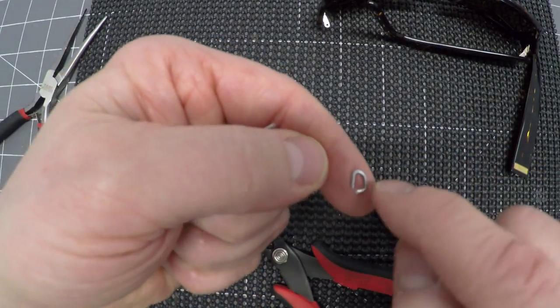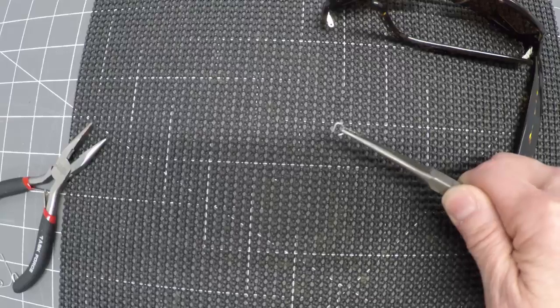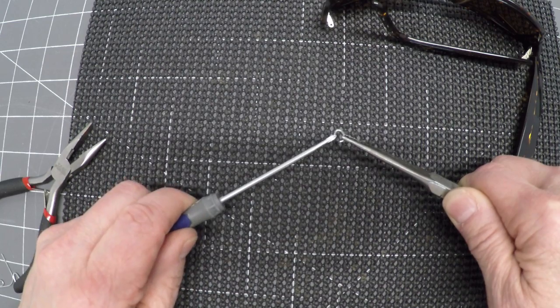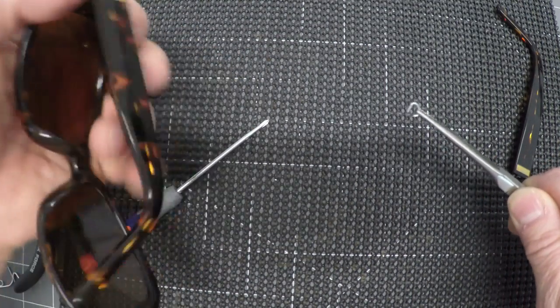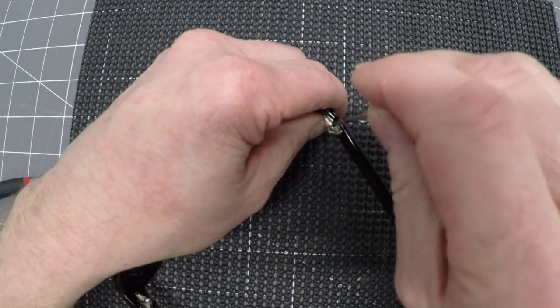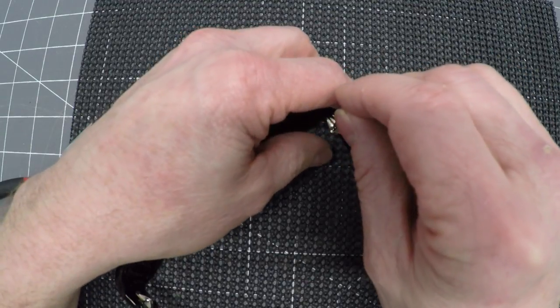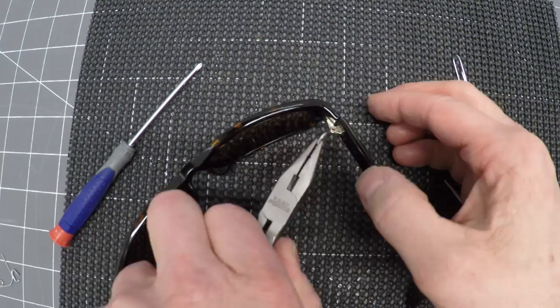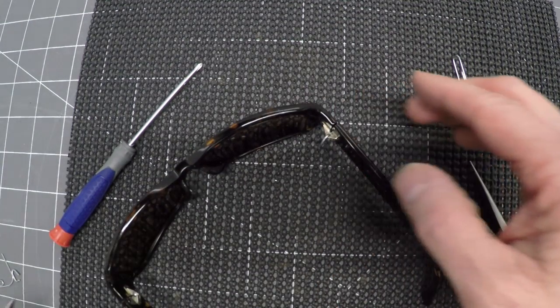There's your D. Now you're going to open this up and then slide it in the hole. You don't want to open it up too much. You just want to open it up just enough so you can slide it down where the screw used to be. Get your glasses back in place, bring them together. Take the smaller paper clip in place. Take your manufactured screw replacement, put it in your pliers and slide it down in there. Just goes in real easy like that.